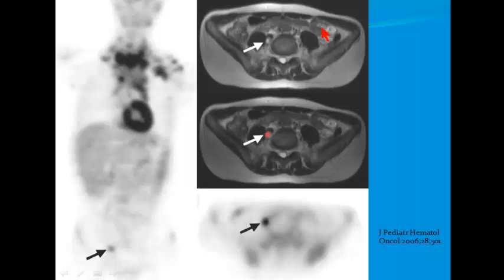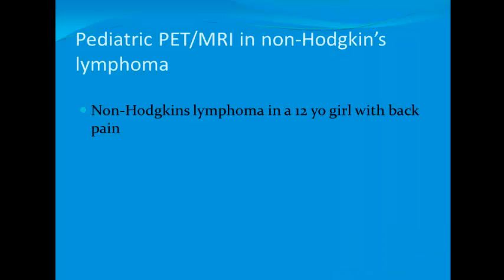So it's thought to be within the ureter, but then on fusion imaging, it was seen to correspond with an enhancing nodule, and this did upstage the patient, so they had parailiac lymph nodal disease. So now the patient went from having stage 2 disease to having stage 3 disease because of the PET MRI combination approach.